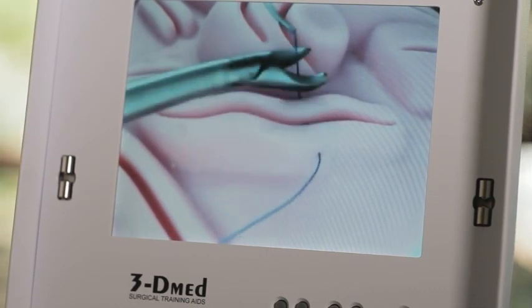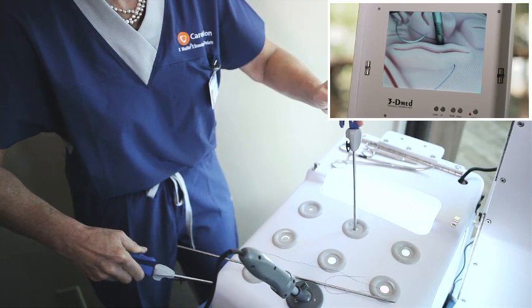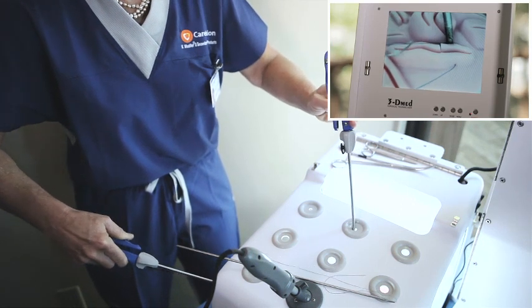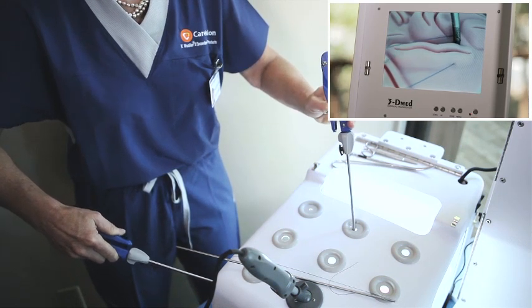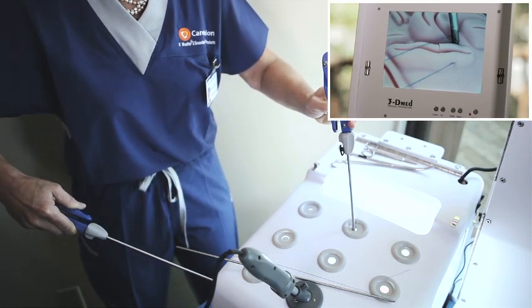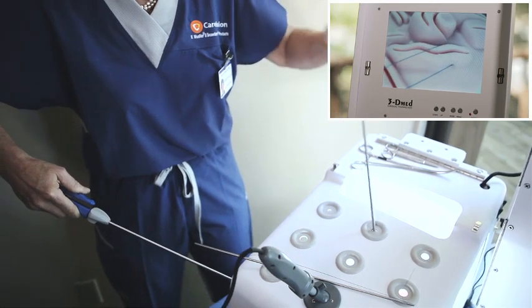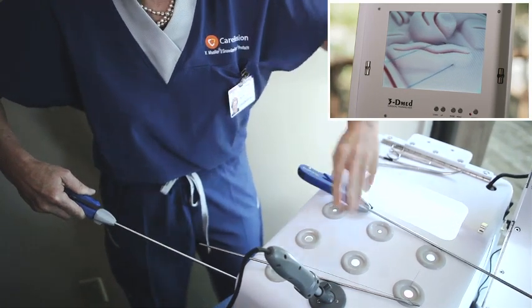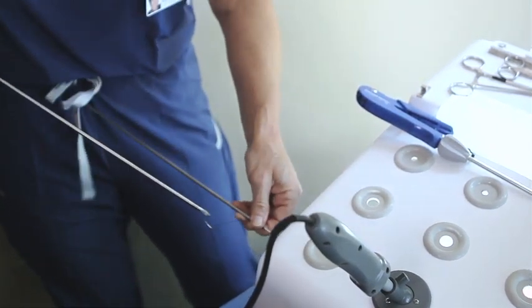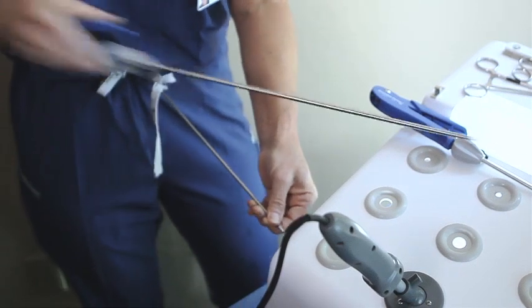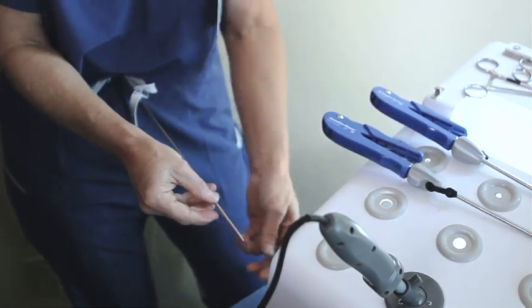We will pass it through as if we're doing our sacroculpopexy, then pull the needle through the tissue. I will bring the needle out. As I pull the needle through, to be gentle on the tissue, I'm going to support it by placing my grasper so that I'm not distorting the tissue.